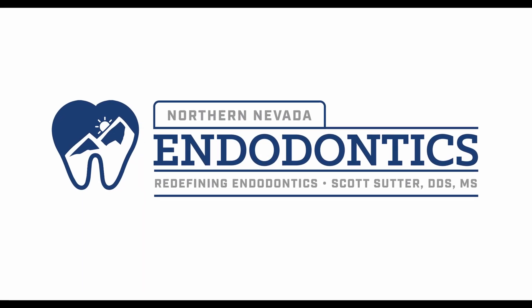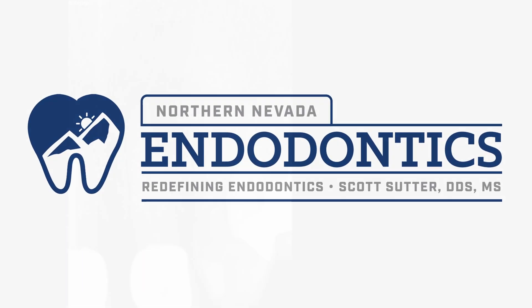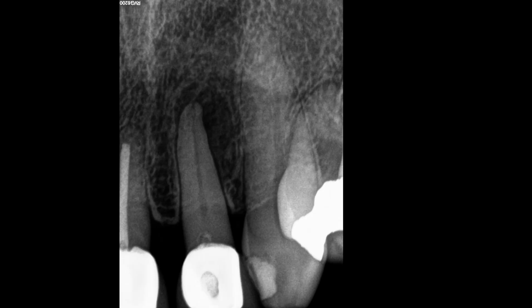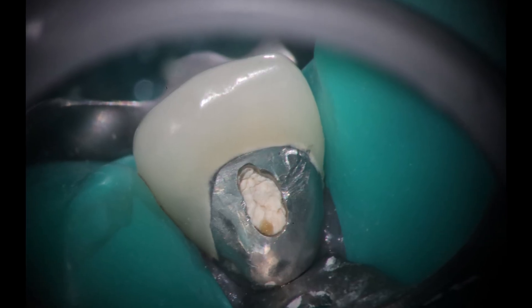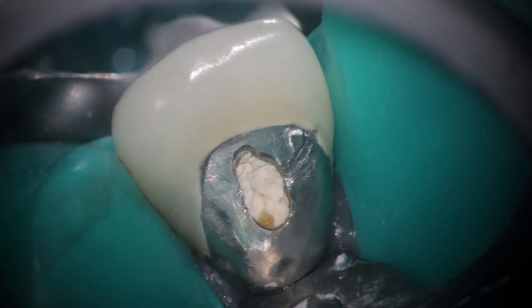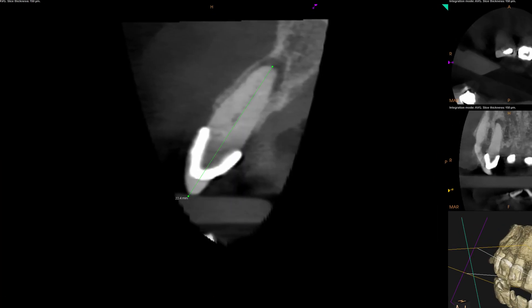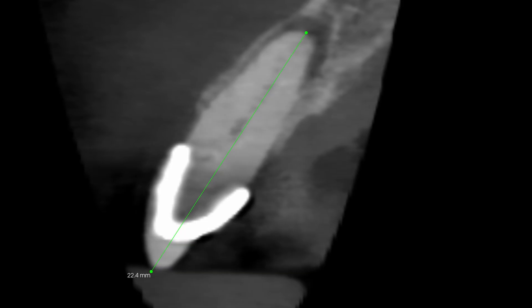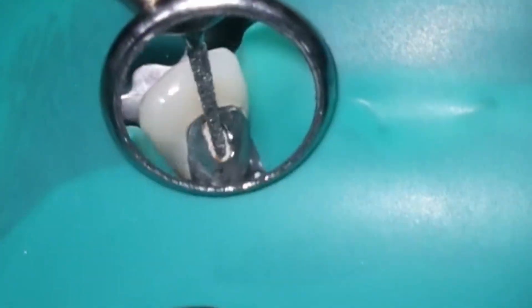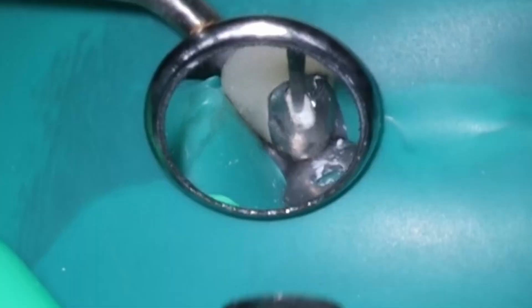Hello everyone and welcome back. Today we're going to be talking about accessing anterior teeth. I got this referral — it had already been started. They said they put calcium hydroxide in. Here's what it looked like clinically, and you can see it's that traditional cingulum access. The problem is, look at where the cone beam shows the actual long axis of the tooth is, and you often miss these canals. Even though they had put calcium hydroxide inside the tooth, they didn't actually find the canal.